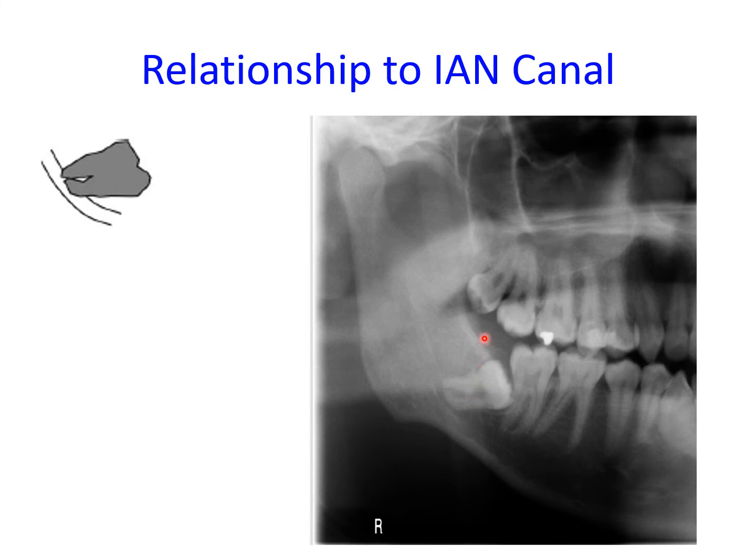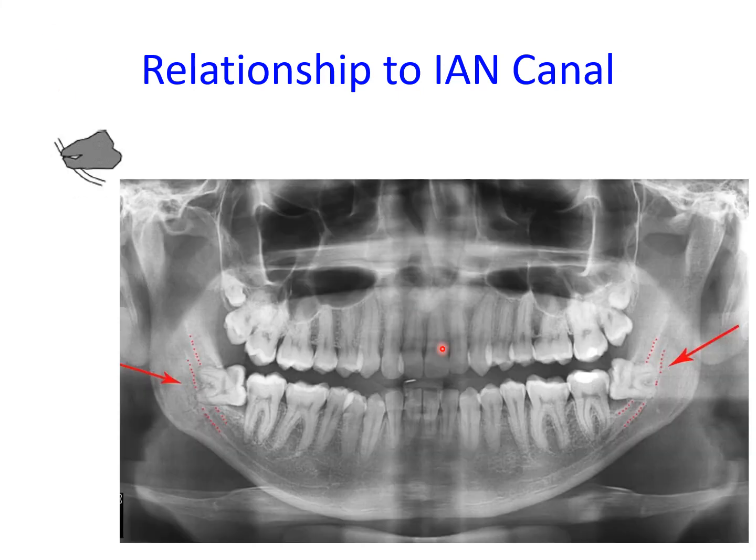And it is generally these categories of wisdom teeth which warrant a cone beam CT for treatment planning, whether you are going to carry out a conventional surgical extraction or whether you may need to do a coronectomy. Finally, the highest risk of inferior alveolar nerve damage is associated with impacted wisdom teeth where the root apices completely overlap the inferior alveolar nerve canal shadow.